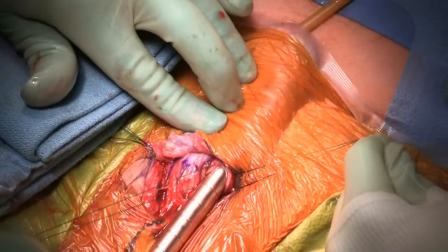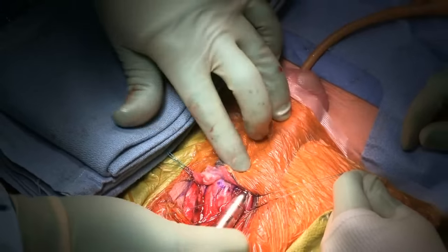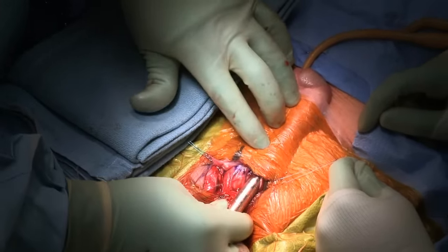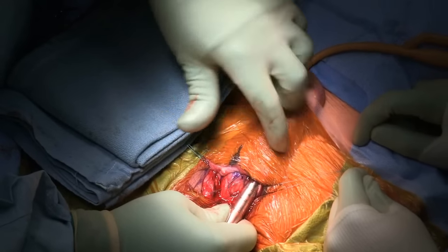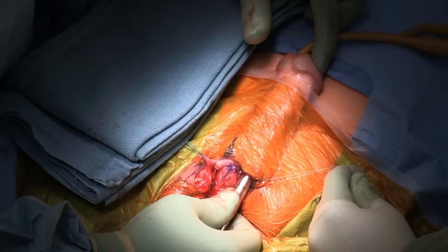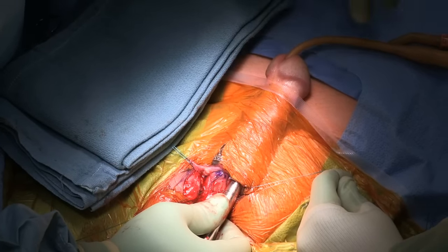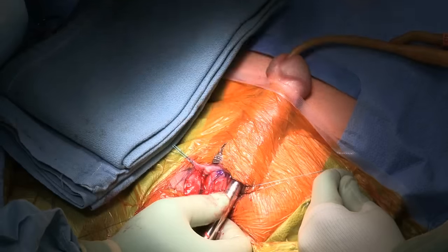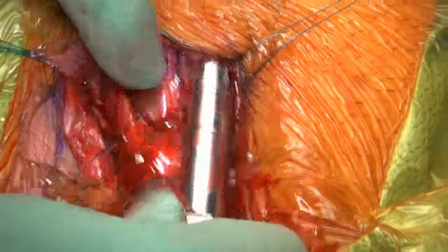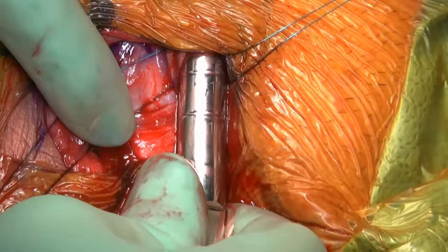I fan out my fingers over the urethra to assure that the dilator does not cross over to the opposite side. If the dilator begins to deviate or if I notice that I don't have even spacing of the corpora, that might indicate a crossover event. Again, I feel the tip of the dilator under the glans. If we're having trouble reaching the dilator to the tip, it is important that we push the glans down to the dilator rather than the dilator into the glans. Forcing the dilator into the glans can lead to a distal corporal perforation. The patient measured proximally 9 cm and distally 12 for a total measurement of 21 cm.